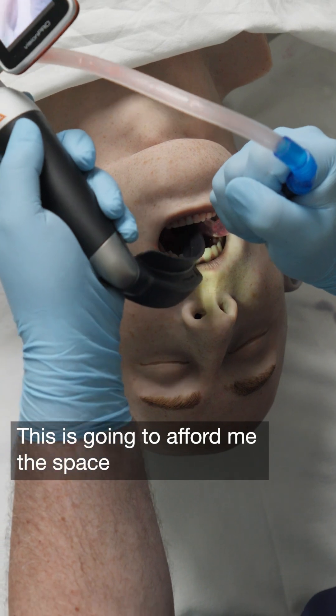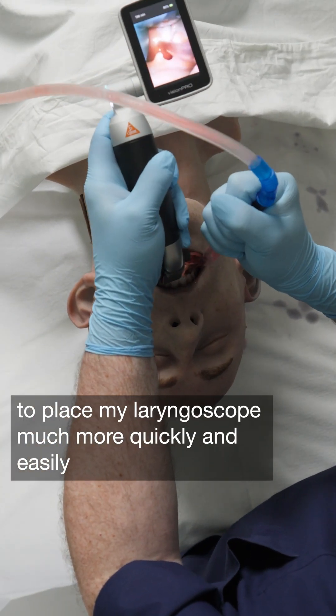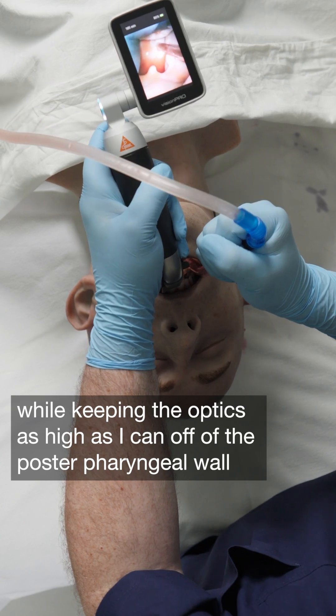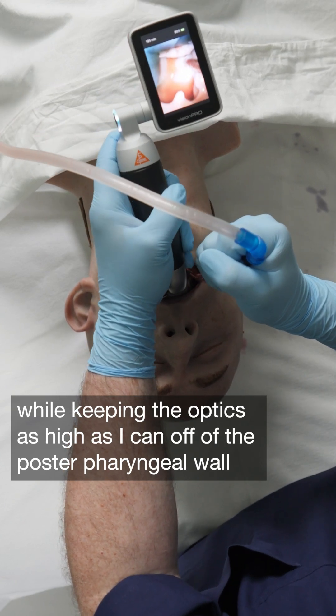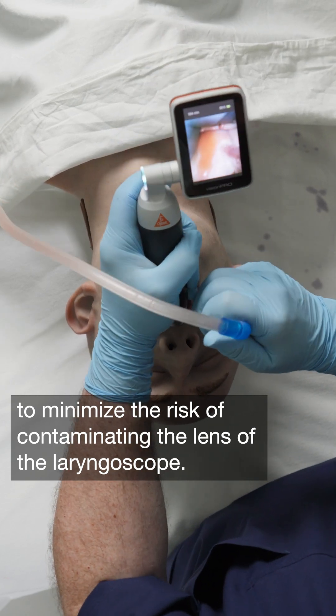This is going to afford me the space to place my laryngoscope much more quickly and easily, while keeping the optics as high as I can off of the posterior pharyngeal wall to minimize the risk of contaminating the lens of the laryngoscope.